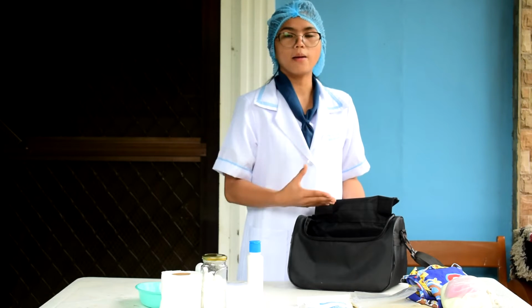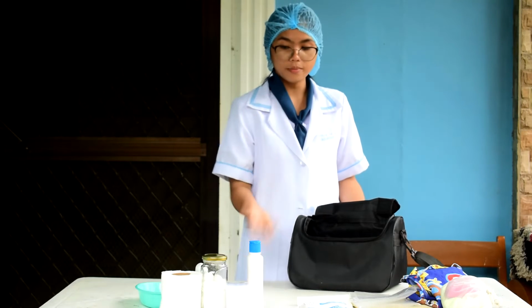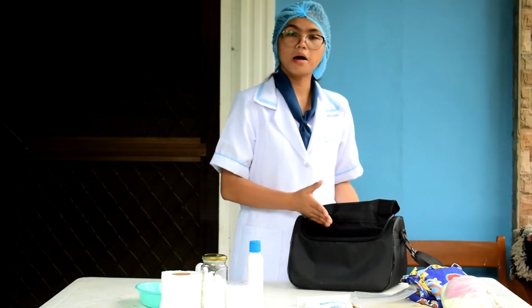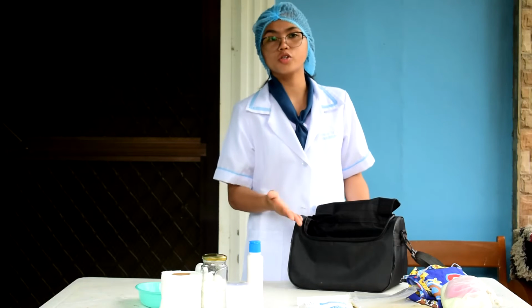Also here, your hypoallergenic plaster, two pairs of sterile forceps, sterile cord clamp, four pieces of disposable syringes with needles, kidney basin, hot water bag, ice bag, sterile cotton applicator, and you also have a sterile tongue depressor, tape measure, and empty glass container.